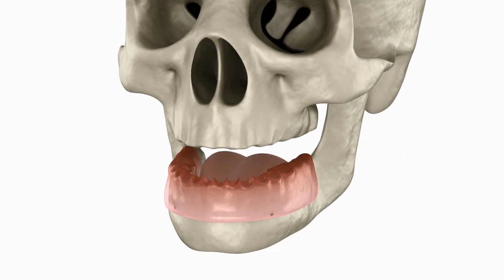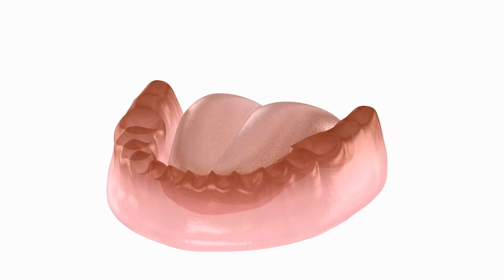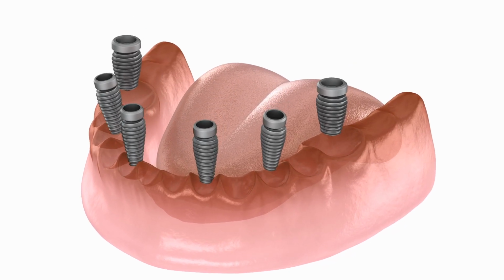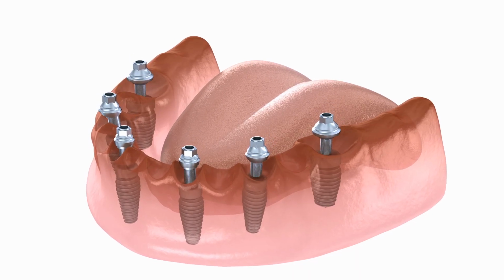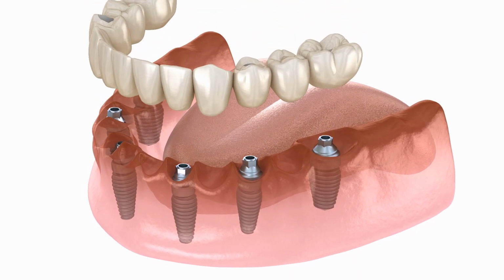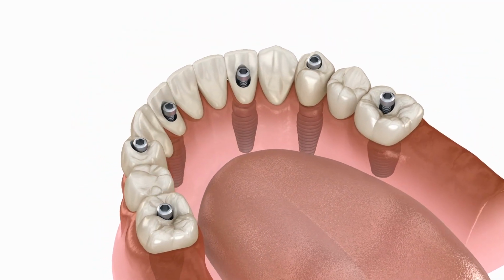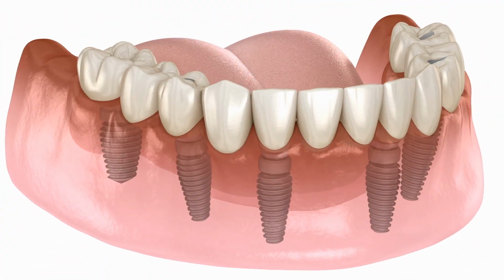Every student must understand this principle for modern treatment planning. Conclusion. To summarize Lesson 2, choosing an implant is a highly engineered decision. You must select the right tool for the job. Do you need grade 5 strength for a narrow posterior space? Do you need a tapered macro design for immediate stability in soft bone? Do you require the hermetic seal of a Morse taper connection to reduce peri-implantitis risk?